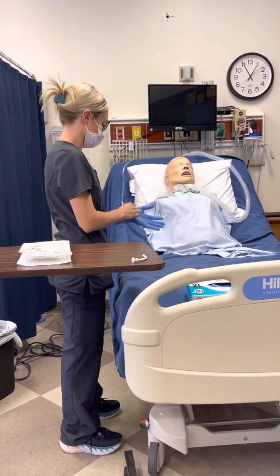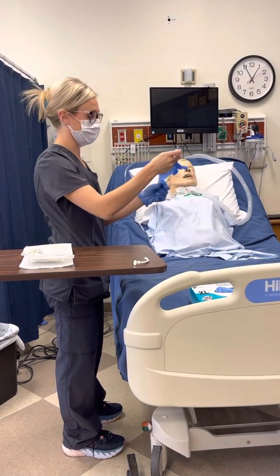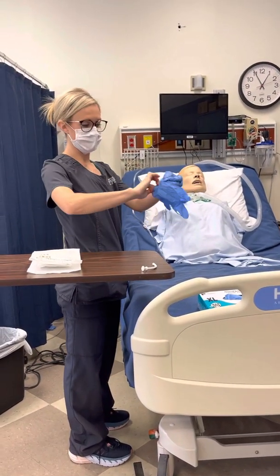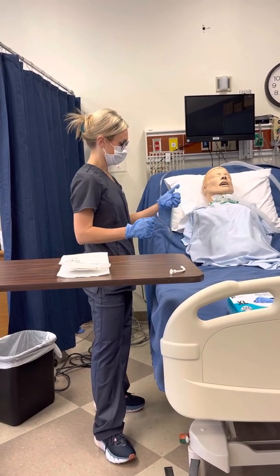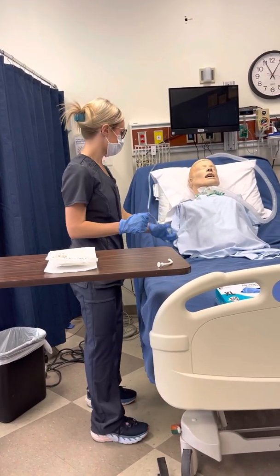Before I begin, like I said, I've already set the suction to between 80 and 120. And I'm going to test to make sure that the suction is working well, and it is.